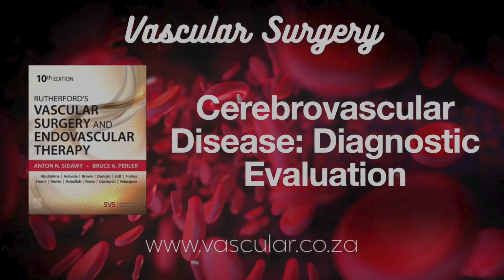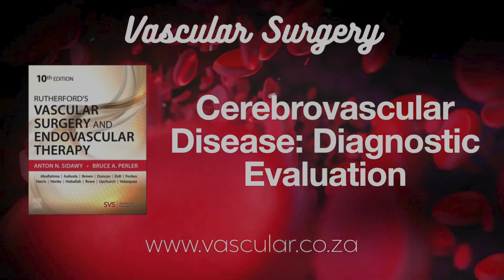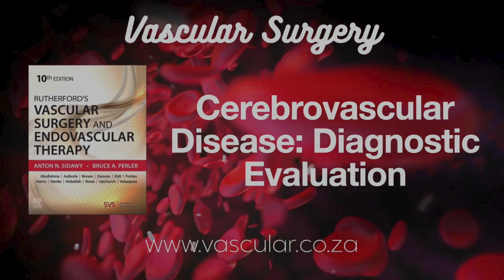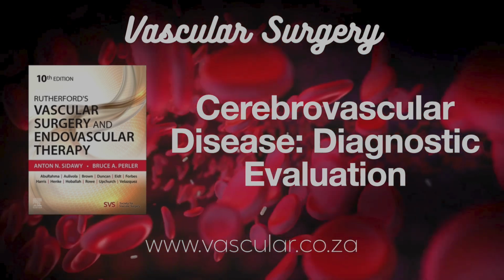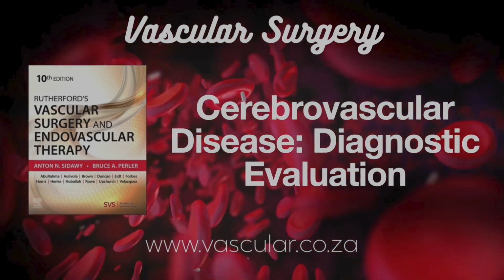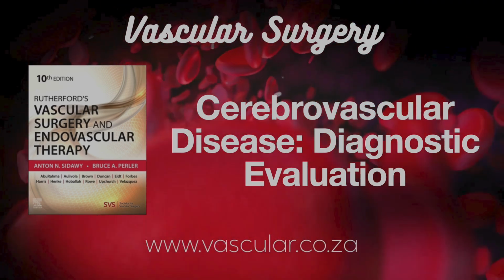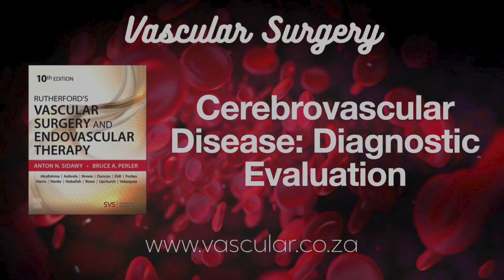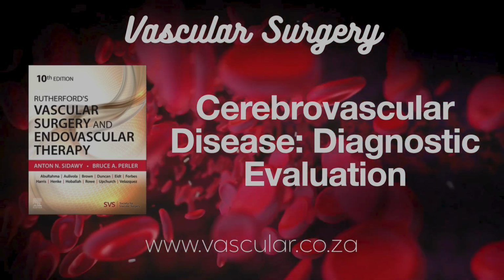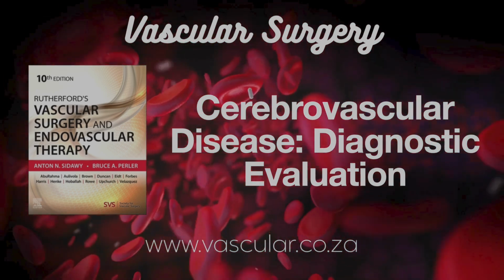So these speed numbers are the clues. Is there like a standard chart doctors use to interpret these? Absolutely. Over time, experts developed what we call consensus ultrasound criteria. They're standardized guidelines looking at both the image and these velocity numbers to grade how severe the stenosis is. Makes sense. And they're particularly good, these criteria, for spotting the really significant narrowing, say over 70%. That's often a point where intervention might be considered. Having that standard approach must be key.